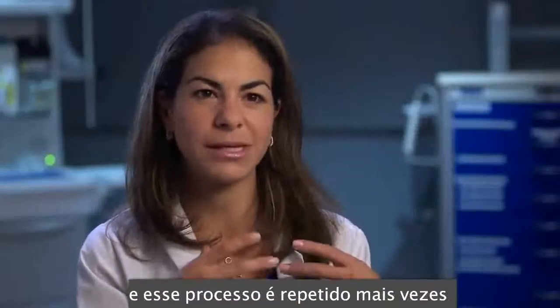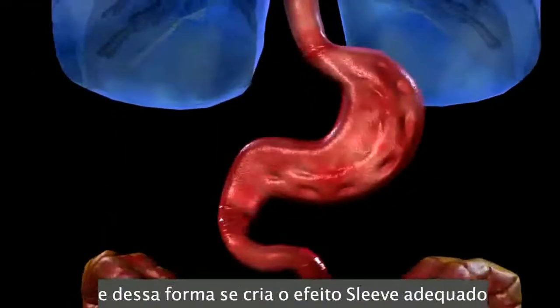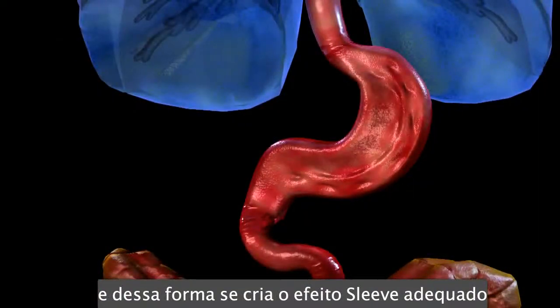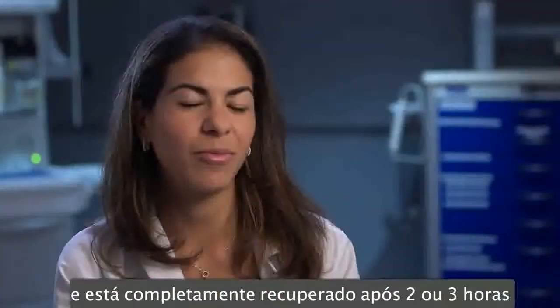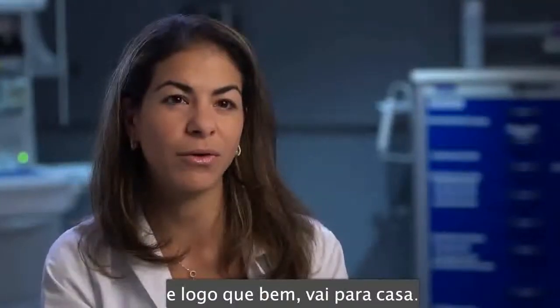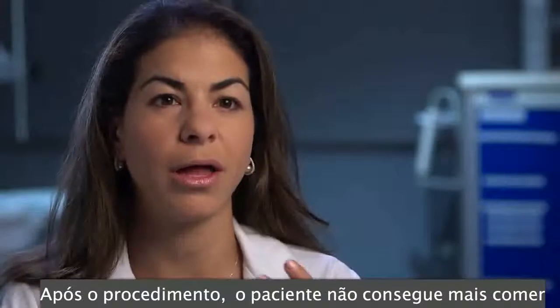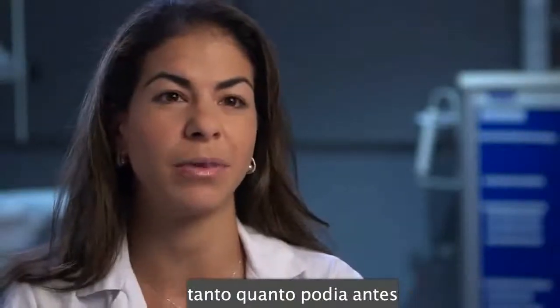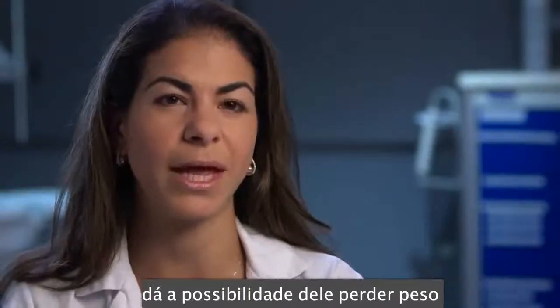You repeat this process several times from the bottom end of the stomach to the top end, forming a really nice sleeve. Afterwards the patient goes to the recovery room and stays there for between two to three hours, then recovers and goes home. After the procedure you're unable to eat as much, so that plus diet and exercise gives you the ability to lose weight.